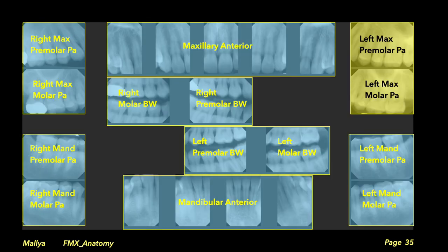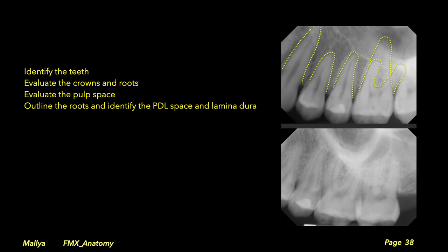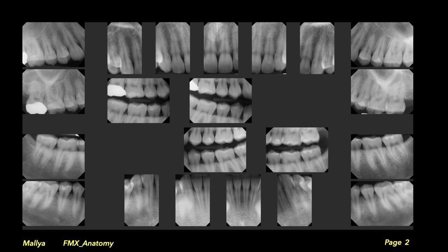We then move on to the left maxillary posterior region and go through the same sequence as the right side: identify the teeth, evaluate the crowns and roots, evaluate the pulp space, outline the roots, and identify the periodontal ligament and lamina dura. Also identify anatomic structures including the maxillary sinus, the floor of the maxillary sinus, and the zygomatic process of the maxilla. With that we would have completed the analysis of the dentomaxillofacial region of the maxilla extending from the tuberosity of one side to the tuberosity of the other side, using a systematic approach to evaluate the teeth, the pulp, the surrounding periapical bone, and the adjacent anatomic structures.